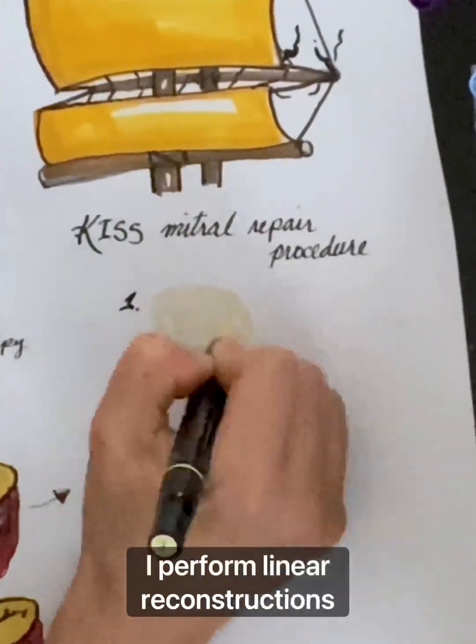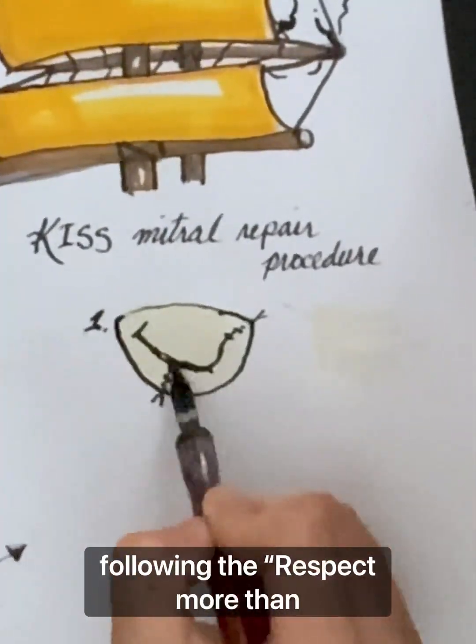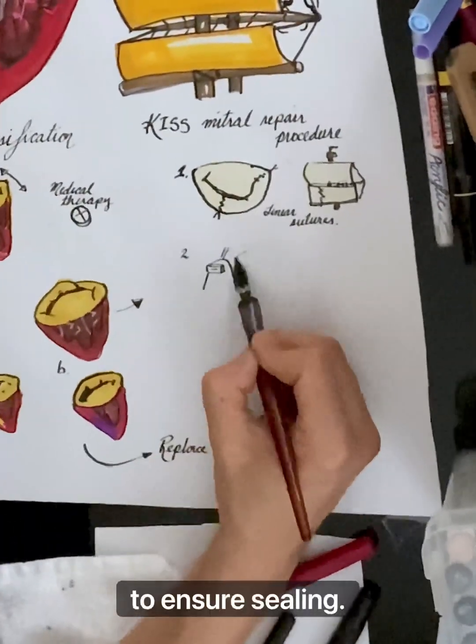In the first step, I perform linear reconstructions of the mitral valve. This involves preserving the valve edges following the Respect More Than Resect philosophy, which minimizes tissue resection. I use an invaginating suture to ensure sealing.